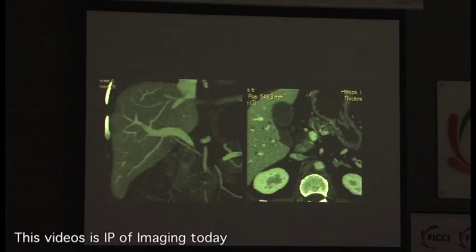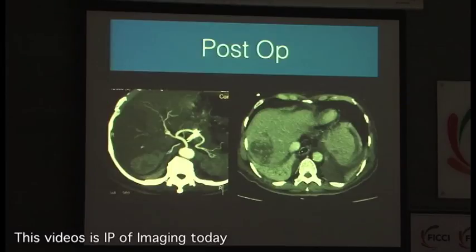So we told our surgeon, this might be involved. Oh, he'll take it out. So, okay. So, what happened? The patient was operated. What do you see?